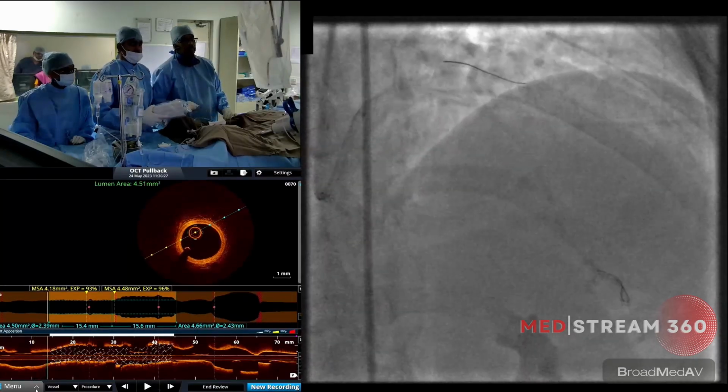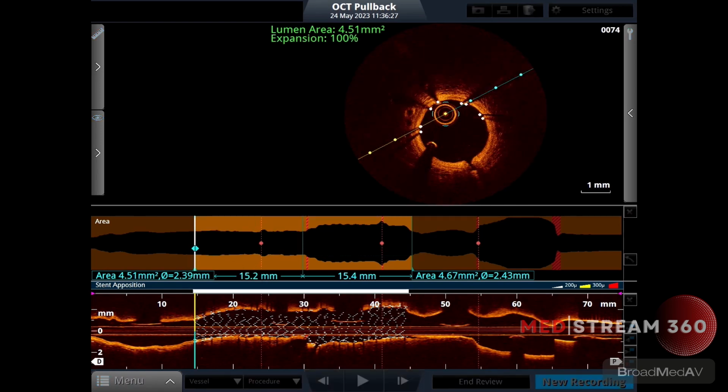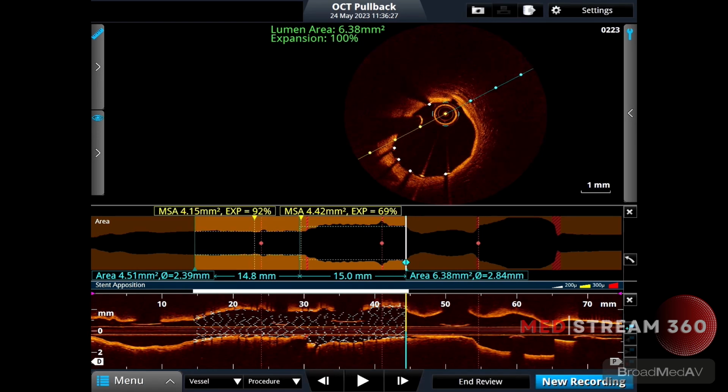Okay, Nanda, I think we got some good pictures. The first thing we are seeing at first glance is the stent divided into two halves. This is a 28 millimeter stent, right, sir? Yes. The length here comes to 30 millimeter, maybe the 28 millimeter elongated to 30 millimeter.